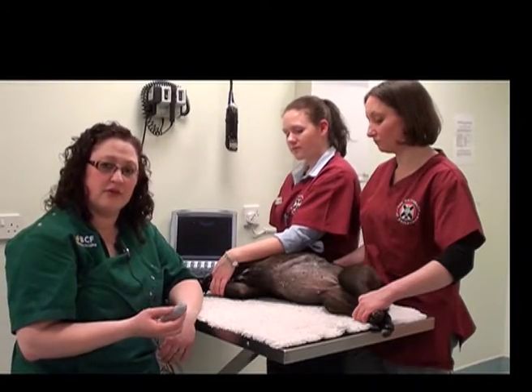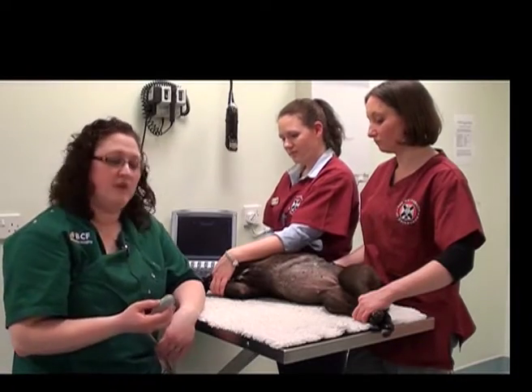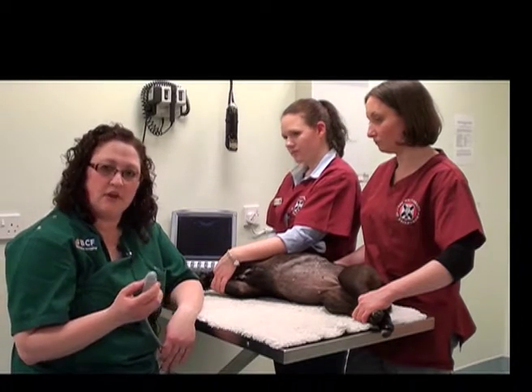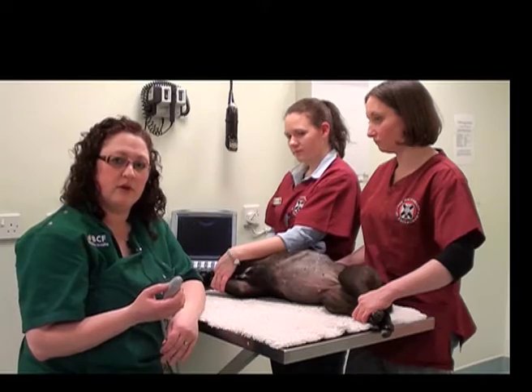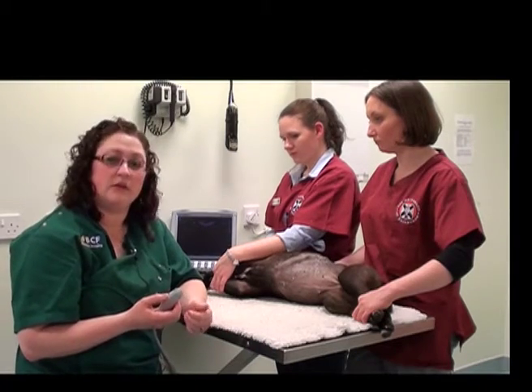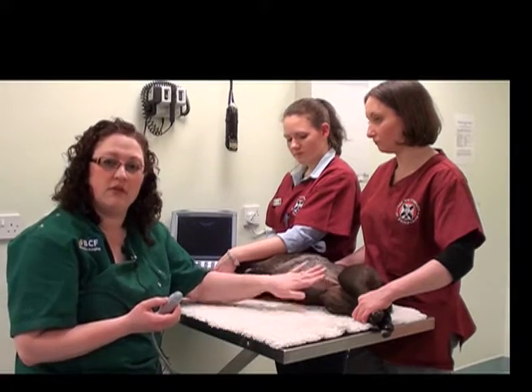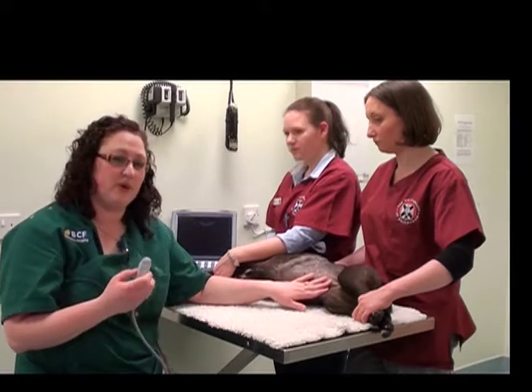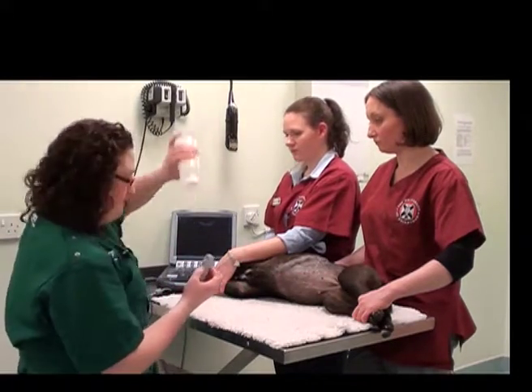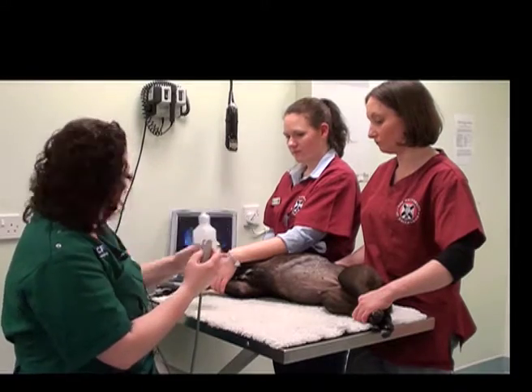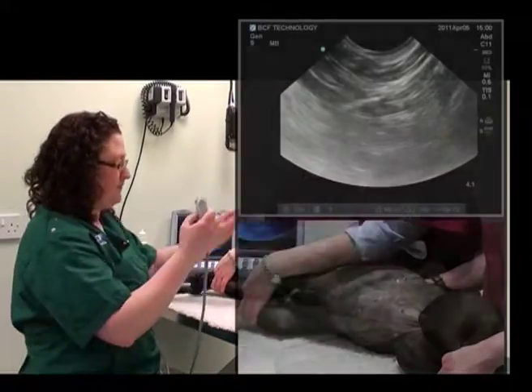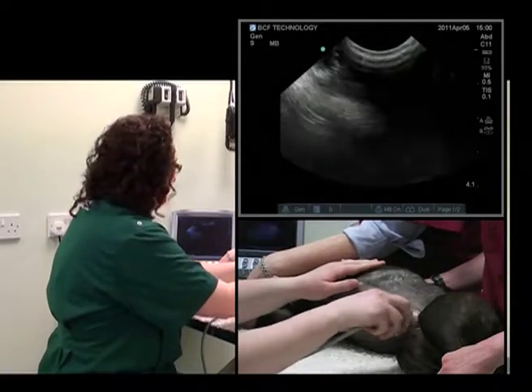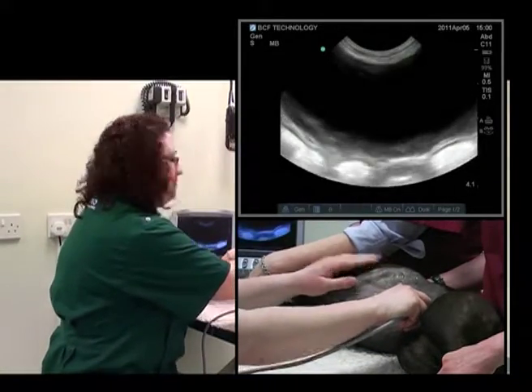The next organ that we'll interpret and find is the bladder, the urinary bladder. This is located exactly where you would expect to do a cystocentesis sample or a manual expression. This is in the caudal midline of the abdomen. We'll add a little bit more gel before we go and do that — and there it is.